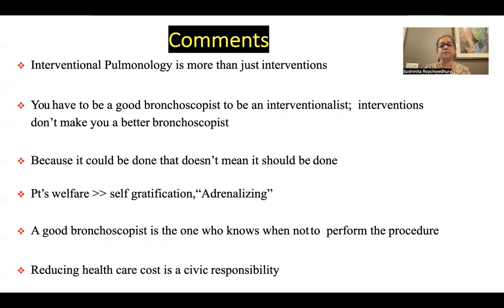But interventional pulmonology is more than just interventions. You have to be a good bronchoscopist to be an interventionalist, and interventions do not make you a better bronchoscopist. So you have to know where you have to do it. Because it could be done, it does not mean that it has to be done. You should be justified in why the procedure is needed. You should be justified in why the patient needs the procedure.